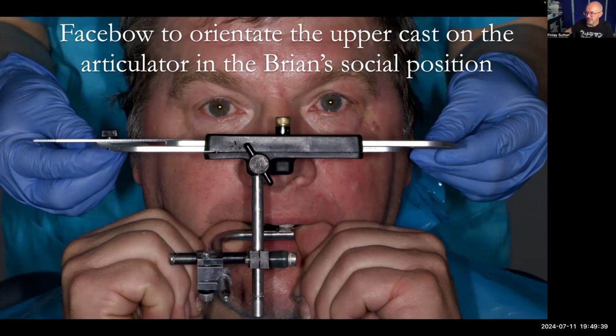So yes, I think one of the really good instructions there, Alexandra, is just look at my case studies on the website. You just go to my case studies on my finlaysutton.co.uk teaching website and click on that. There are lots of different cases with examples of special trays, and you'll be able to find a case that is similar to the one you're doing, and then just ask them to do it like that.